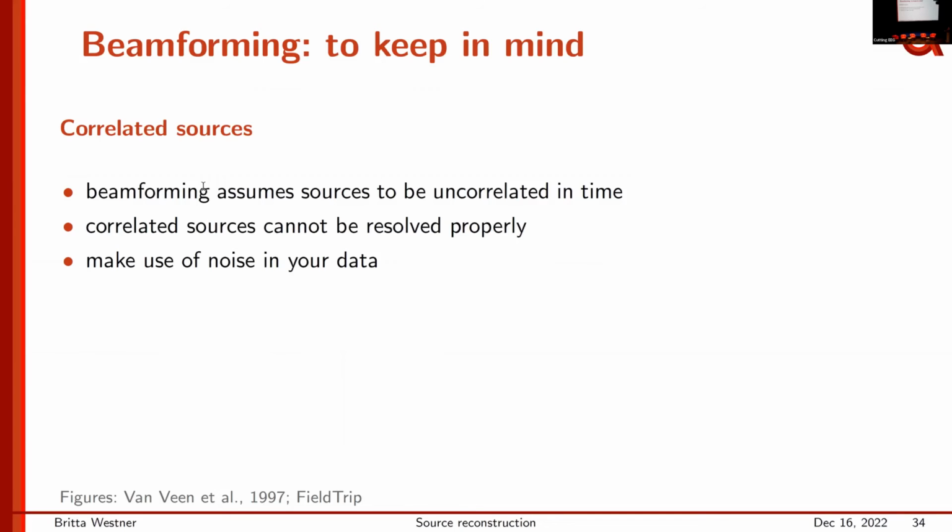We do not take the average first. We take all the epochs you want to use to compute your covariance matrix and concatenate them. We glue them together, getting one large signal. And on that large signal, we compute our covariance matrix. And now you have those subtleties, a bit more noise on the right side of your sensors than on the left, etc. And that will help a lot with uncorrelating those signals. Those little noise components that sit on top of the actual interesting signal can be helpful here.